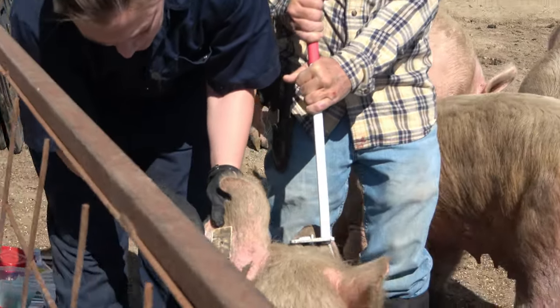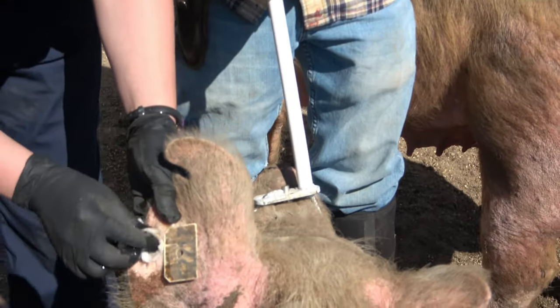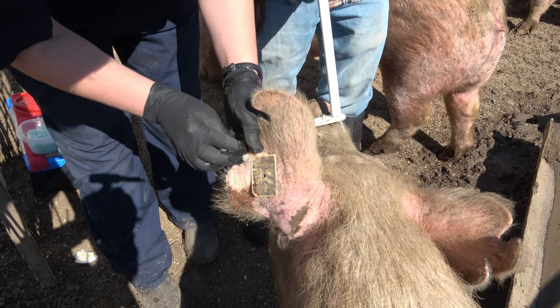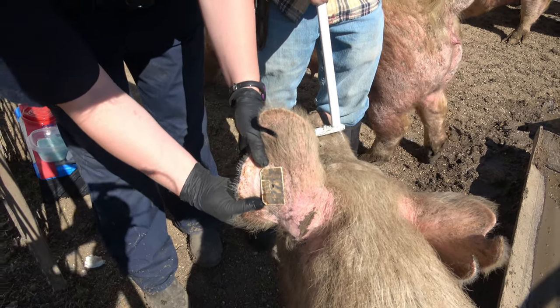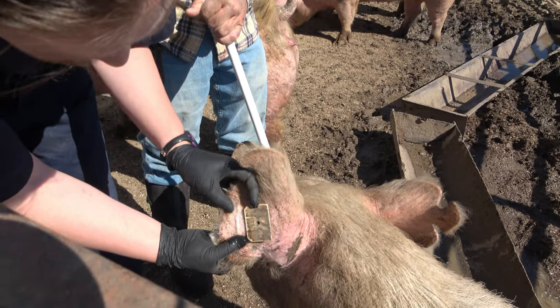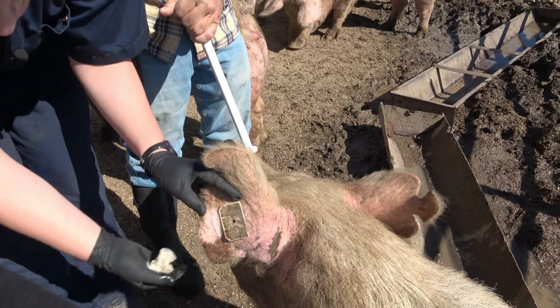So the vein that we're looking for runs right here on the outside of the pinna, and it usually runs right along this outer perimeter here. So you can see when I occlude, this little guy raises right here really well for me. So this is the one that we're going to shoot for today.